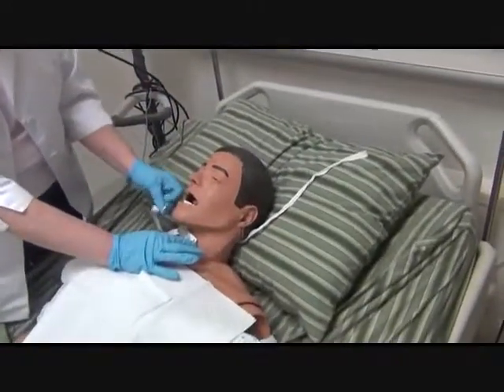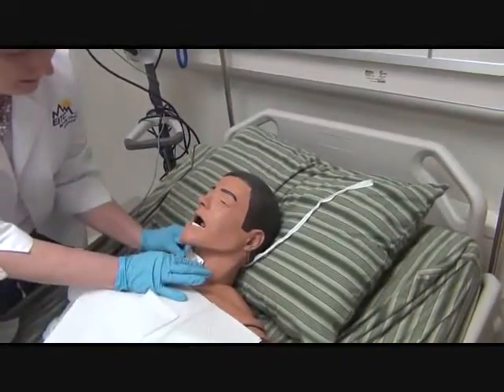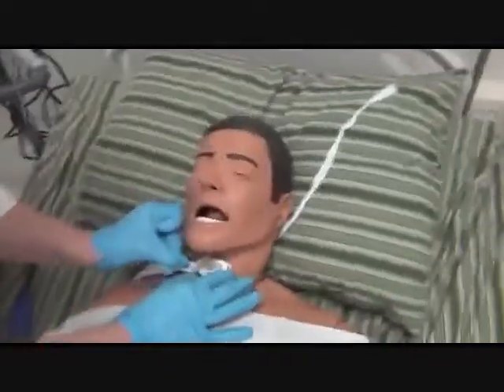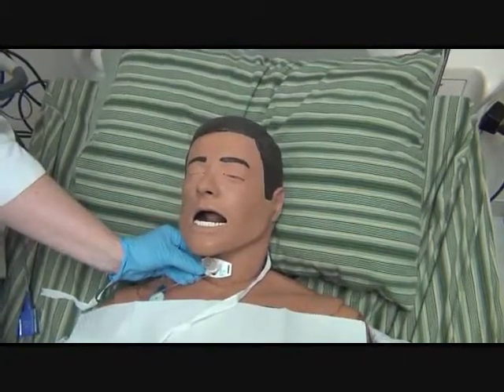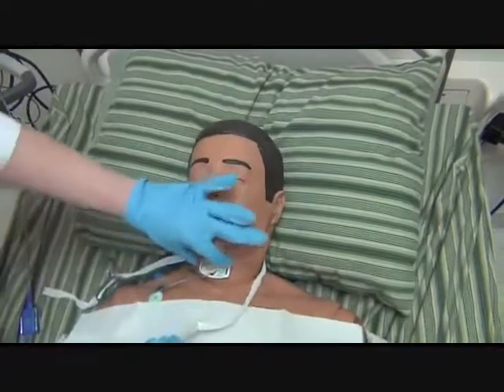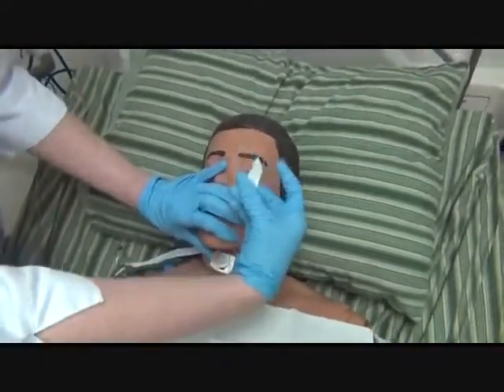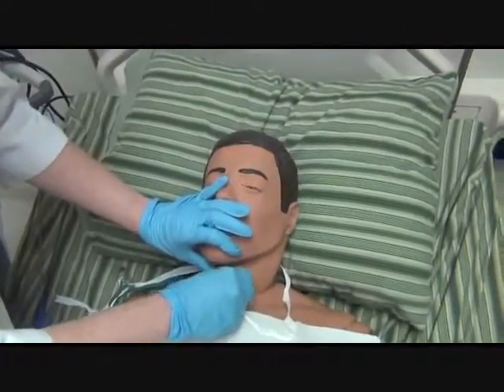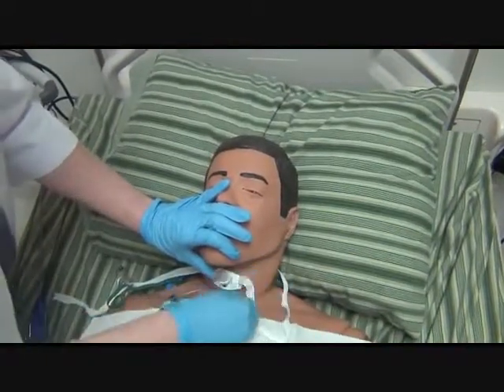Okay, I'll show two different ways to tie. So there's this one where you come in and go on top. Remove the old tie, and again, I have cut these so that they're at an angle. It makes it much easier to go in. And with a real human being, they actually are easier to get.